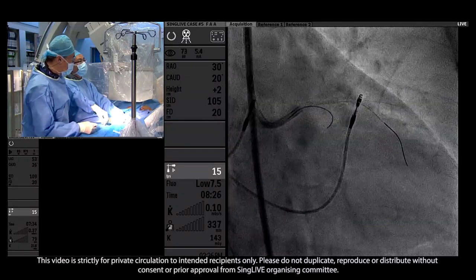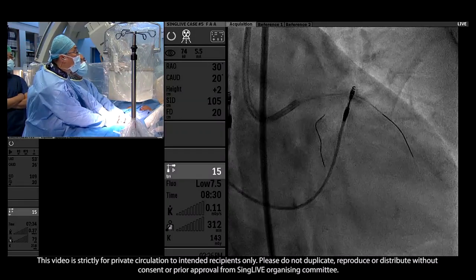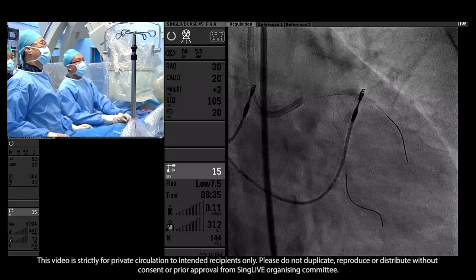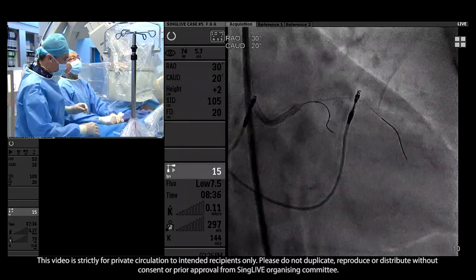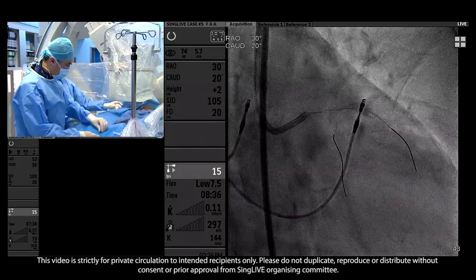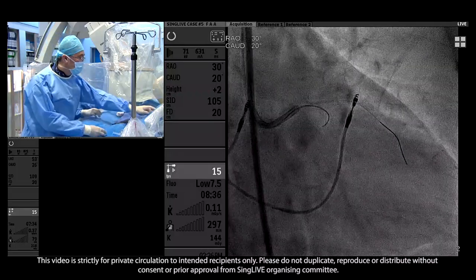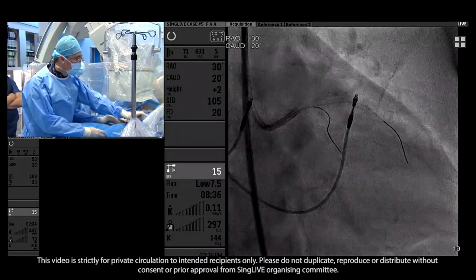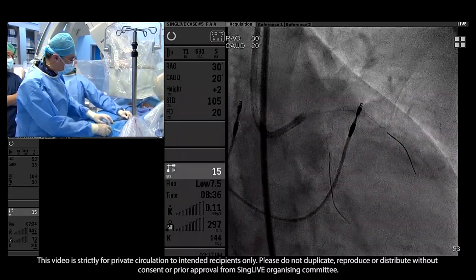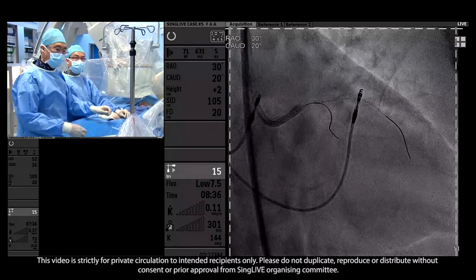So, Kaewoon, most panelists favor DK crush. What's your preference for this patient? Excellent. I think we try to keep it simple. The options of DK crush have been discussed, but the TAP would certainly be a simpler, more straightforward option for this. So we will probably go with TAP after stenting left main to LAD. If everybody's agreeable.